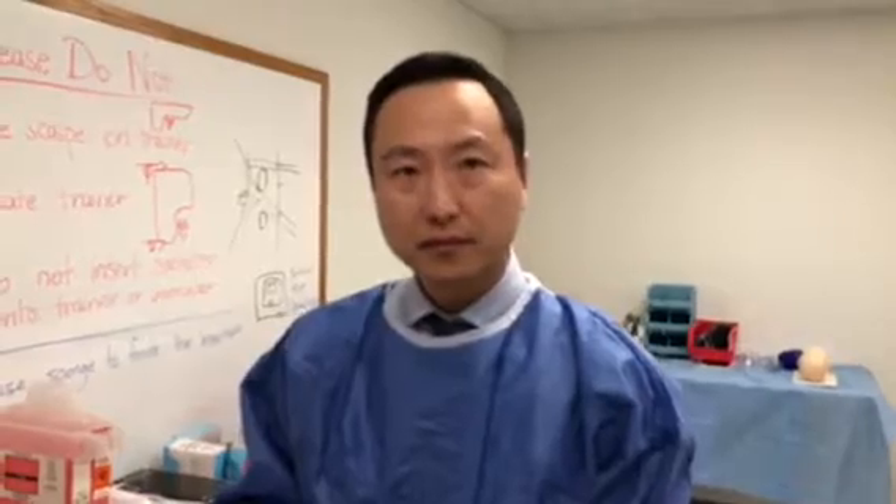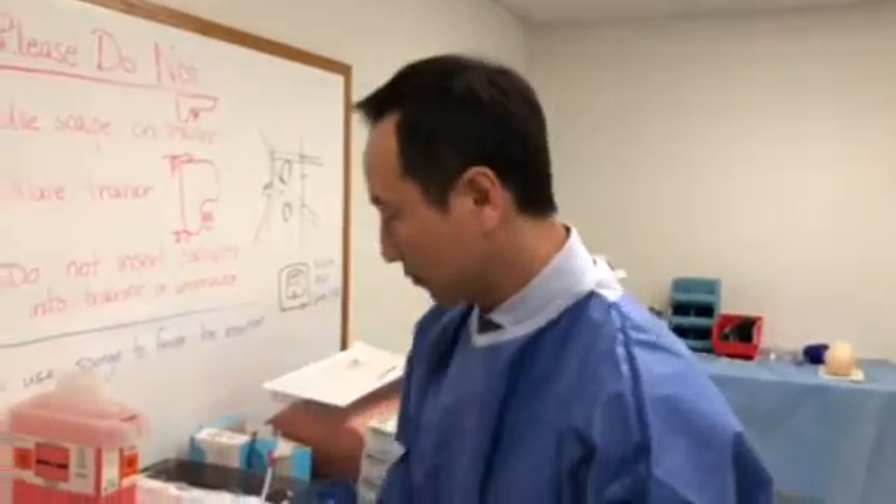We have Dr. Ki-won Kim, Thoracic Surgeon at North Shore University Health System, placing a 12 French quick-pull chest tube.